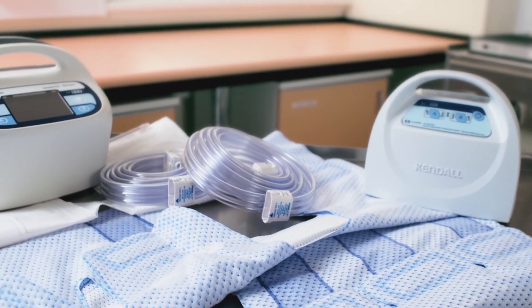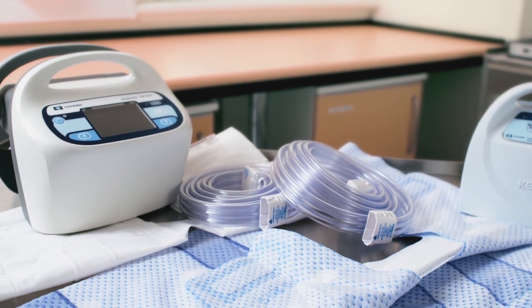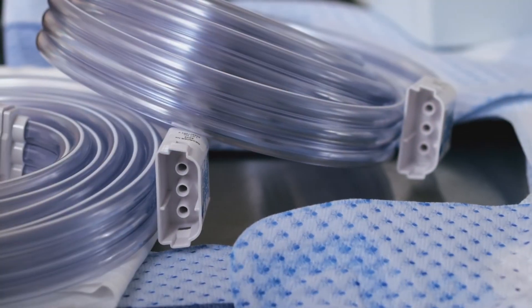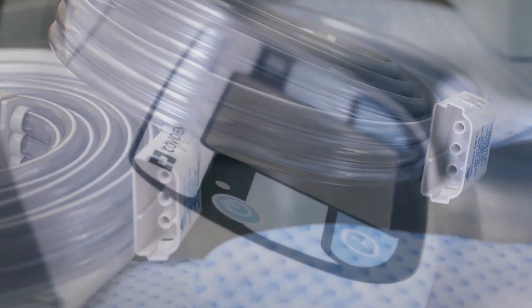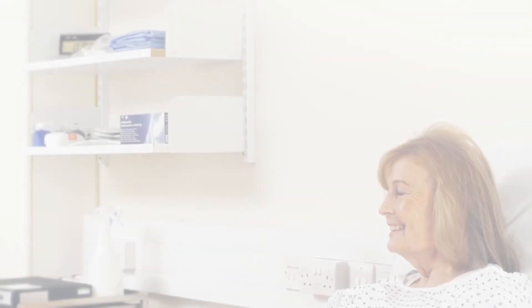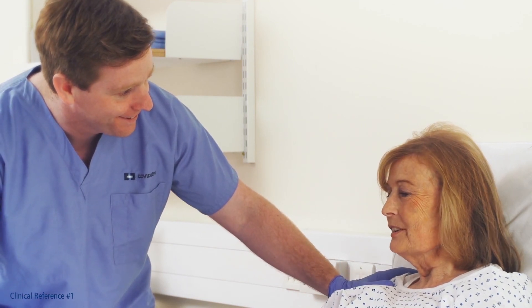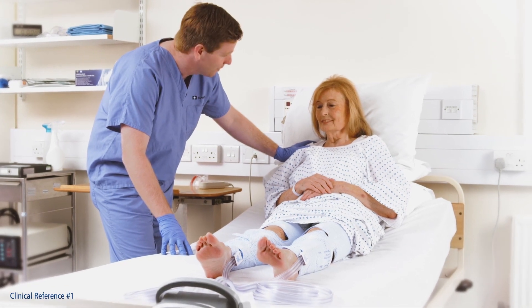The Kendall SCD sequential compression system is the most clinically studied IPC device on the market, delivering a unique combination of circumferential, sequential, gradient compression with vascular refill detection to help reduce the risk of both DVT and PE in at-risk patients. The Kendall SCD system is ideally suited for use with surgical patients and for stroke patients, in whom the device has been shown to help improve survival.